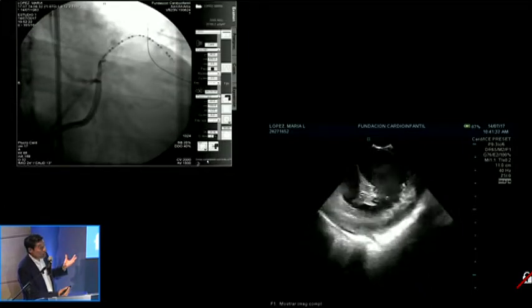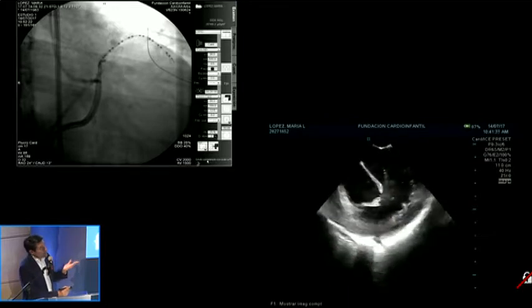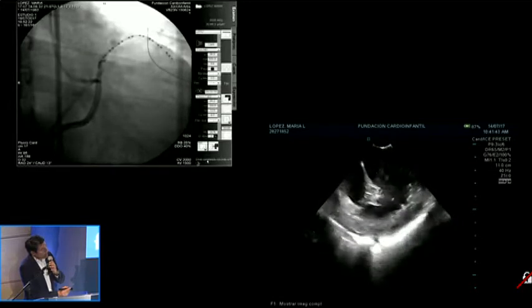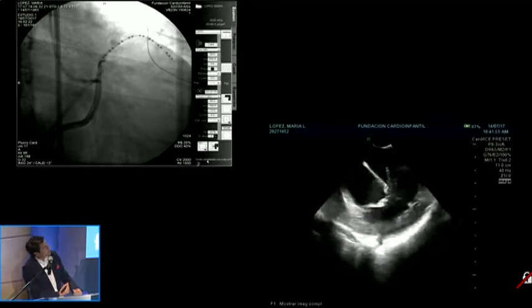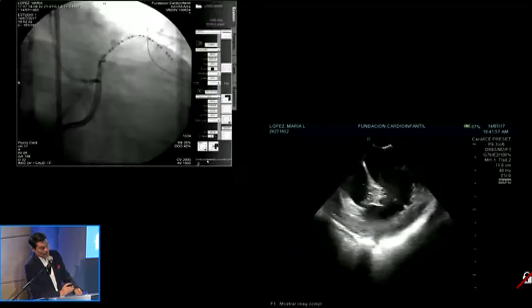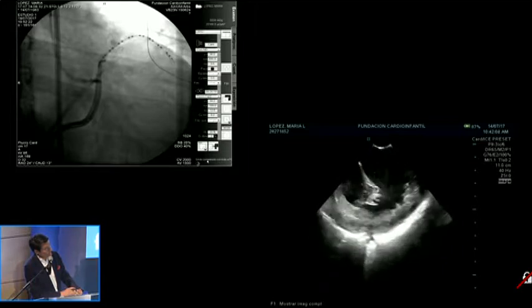And the second thing, they used a multi-electrode catheter. Therefore, if they have already localized the earliest area, Fermin, please tell us here in the audience, based on the location of the wire and the multi-electrode, what is your judgment: is the earliest area that has been recorded epicardial, intramural, in what aspect of the left ventricle?